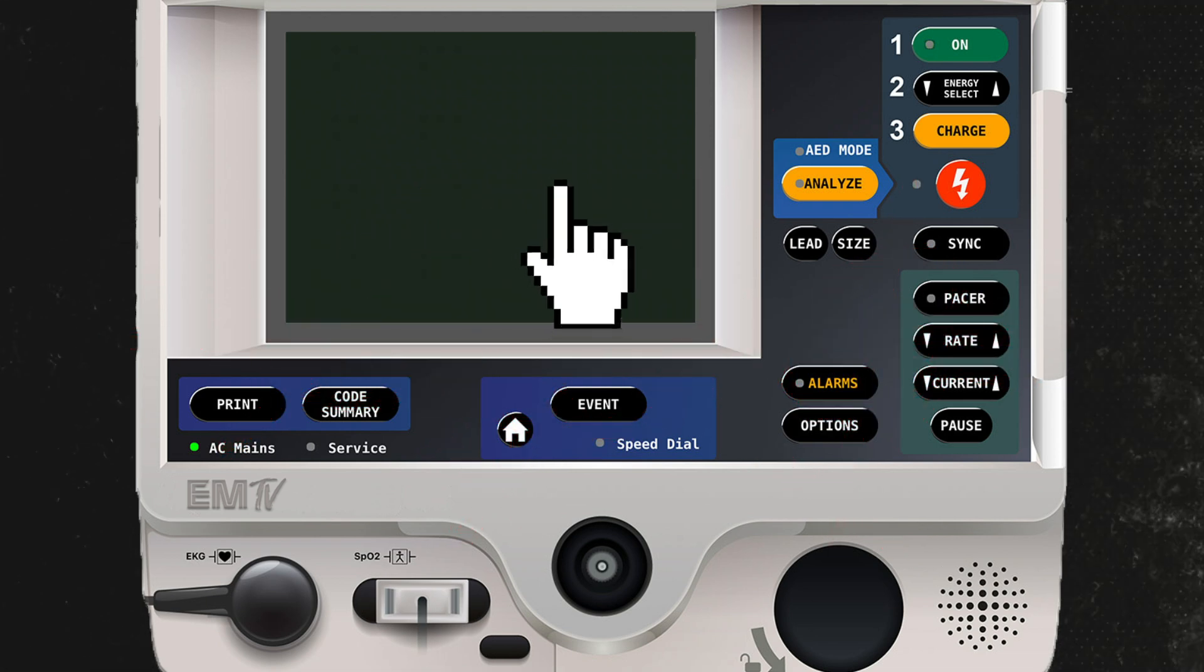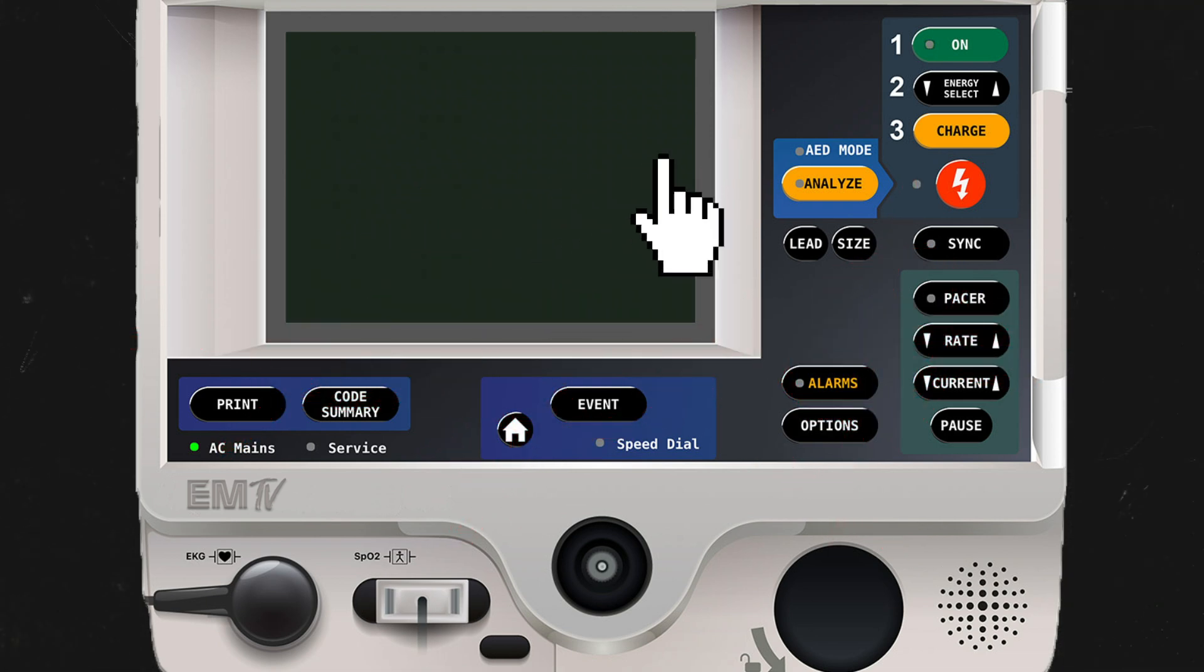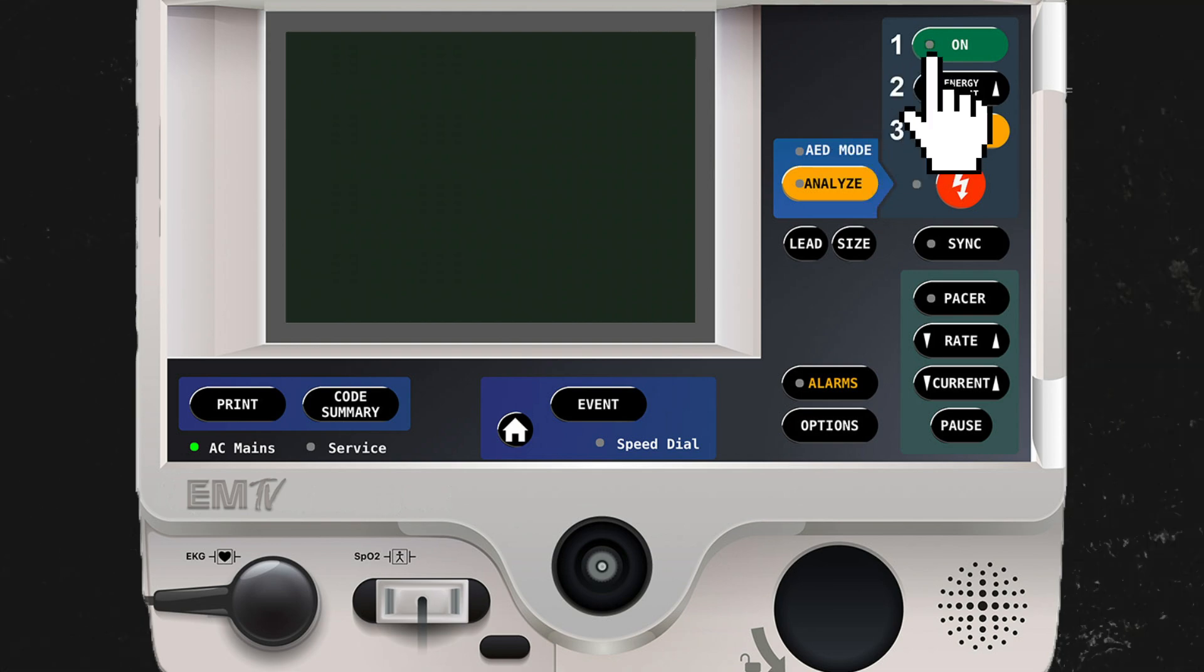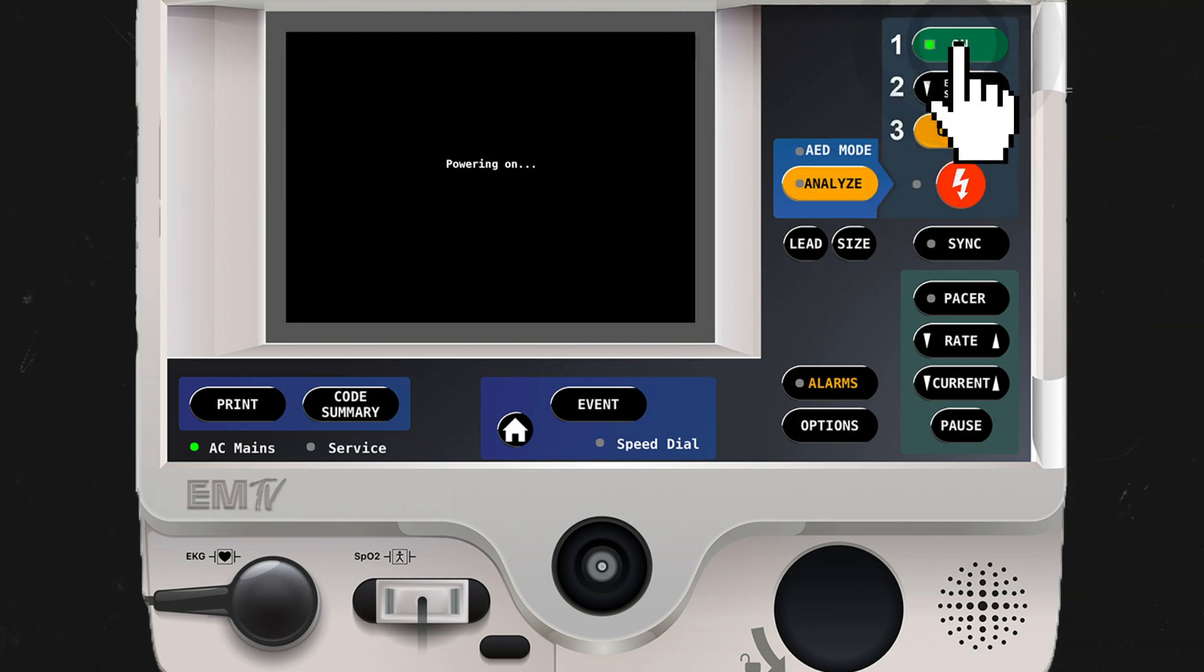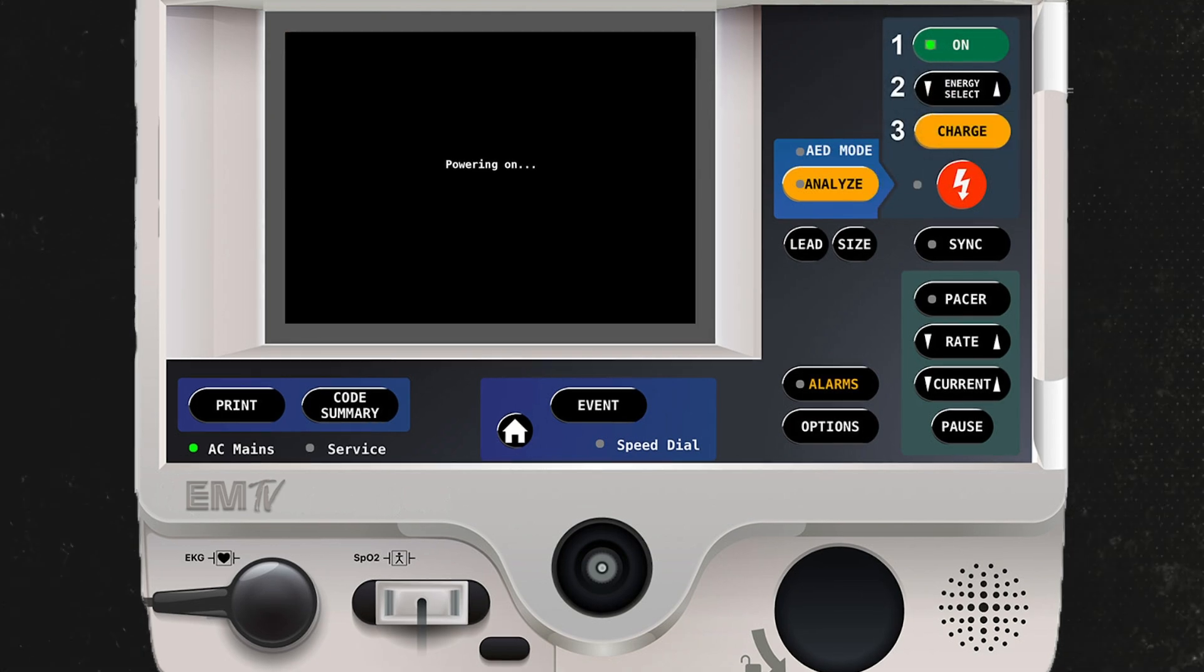The first thing I'll do is turn my device on. Make sure you've attached pads and all appropriate leads to the patient.